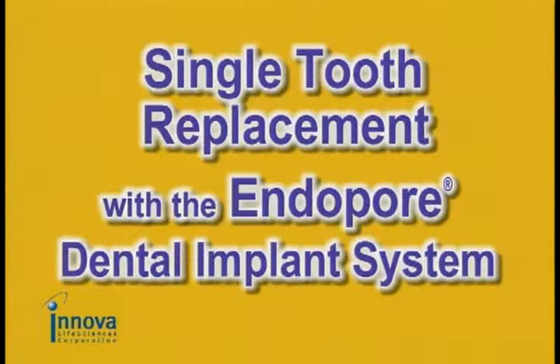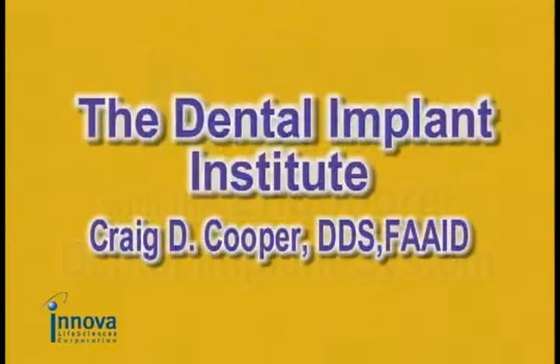The most accurate definition of implantology is that it is a prosthetic discipline with a surgical component, rather than a surgical discipline with a prosthetic component. Today's patient demands to have an implant placed in such a position and such an angle as to afford the most ideal prosthetic result. The placement of the implant must conform to a prescribed prosthetic treatment plan.